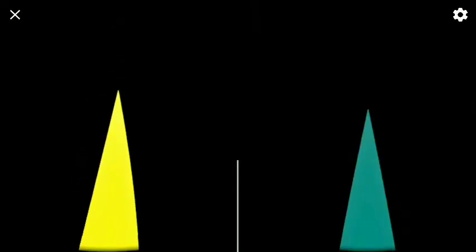Okay, so we've indicated that the left eye is the strabismic eye, and you'll see that this rod is moving around. Don't worry that it bends or is a different shape. That's to do with the lenses in the VR headset. It appears straight in the headset.